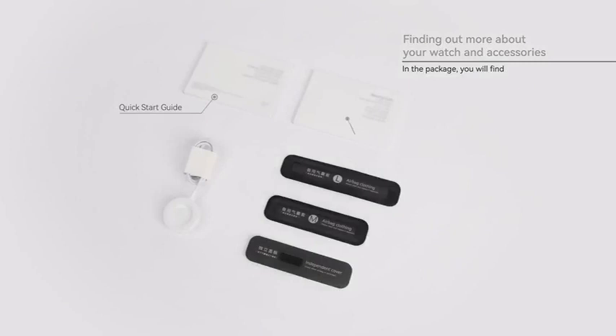In addition, there is a quick start guide, a wearing guide, a charger, spare M and L sized airbag clothings, and an independent cover.